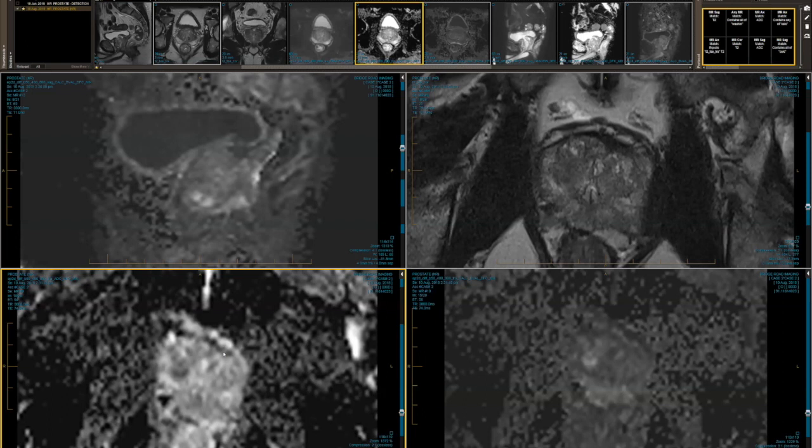So obviously one of the confounders in prostate cancer imaging is granulomatous prostatitis. So if I score a 5 and the pathologist says there's significant chronic prostatitis, then that's again something that you wouldn't have to go back and rebiopsy. I probably said too much, Jeremy, but hopefully I've conveyed some of the PIRADS issues.